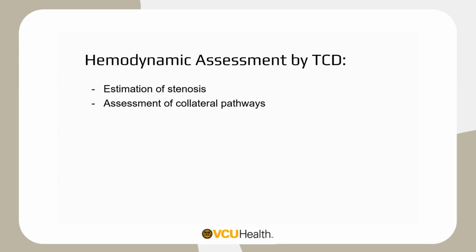And just to narrow the focus a little bit, specifically what I'll try to stick to is talking about the estimation of vascular stenosis by TCD and the estimation of collateral activation of collateral pathways by TCD. So, fairly well-established uses of TCD in vascular neurology and in the ICU.